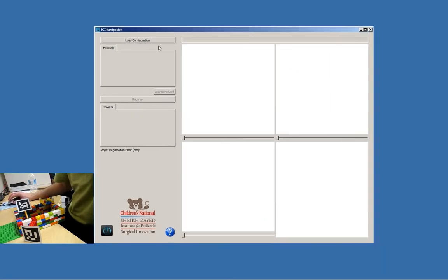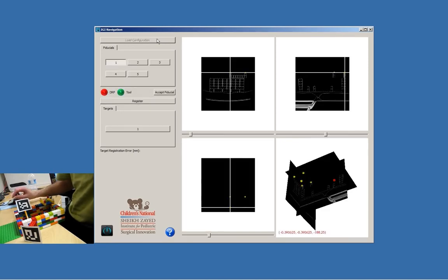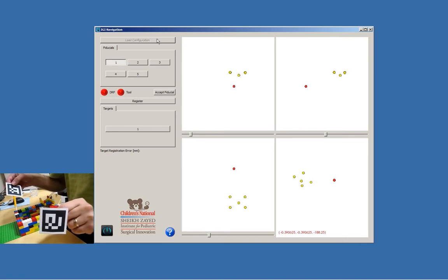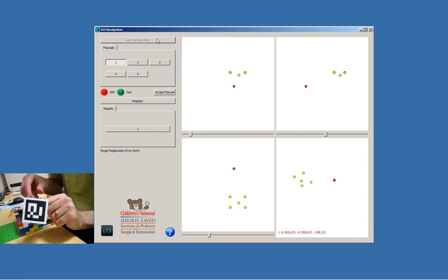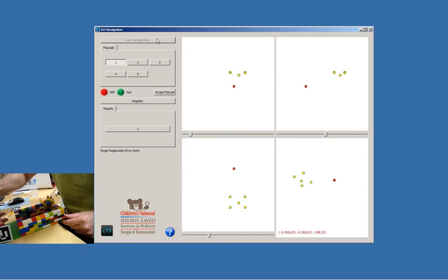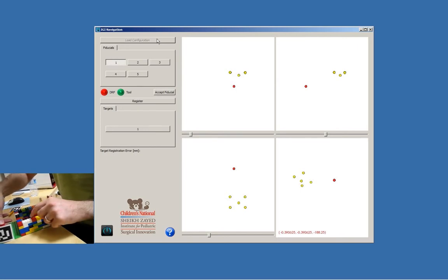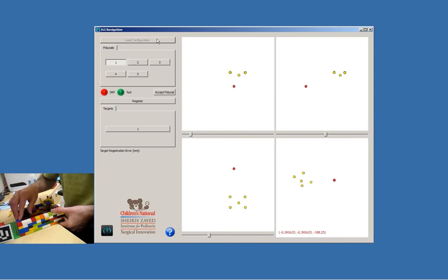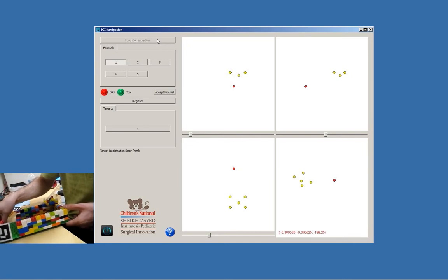We enlarge the view, load our configuration, and the tool is visible. This is our dynamic reference frame and our tool. We attach our dynamic reference frame to our patient and now they're one rigid body, and we will be able to move the patient wherever we want to and the images displayed on screen will still be valid.